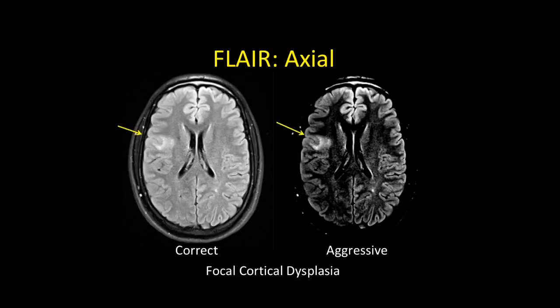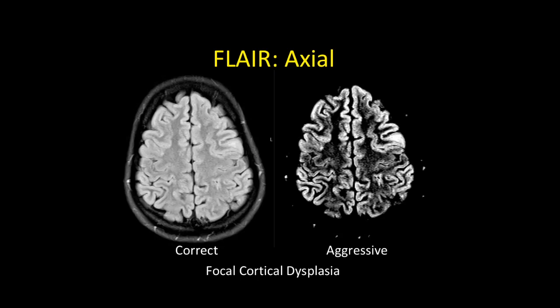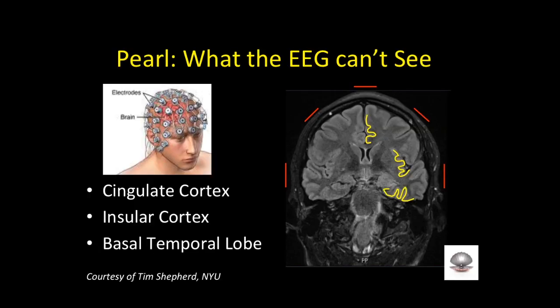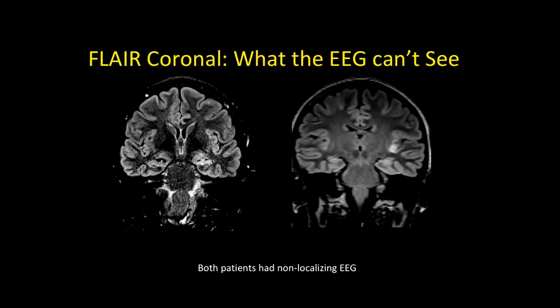Here's a cortical dysplasia you can't miss on FLAIR; here's another you might miss at correct windowing but which stands out when windowed aggressively. A key pearl: look where the EEG can't see. Surface electrodes can't reach deep structures — specifically the interhemispheric fissure involving the cingulate cortex, the insular cortex covered by the operculum, and the basal temporal lobes. Two cases with non-localizing EEG: one had a cingulate dysplasia, the other had an insular dysplasia. Always look where the EEG can't.